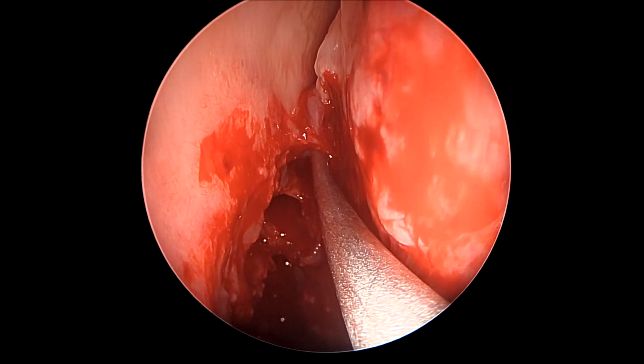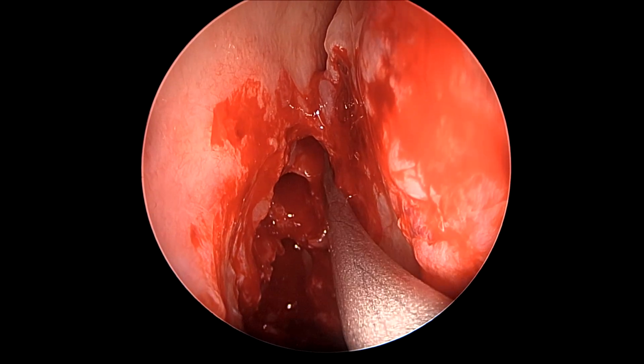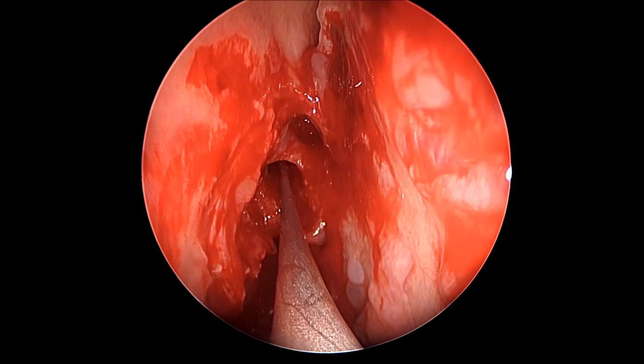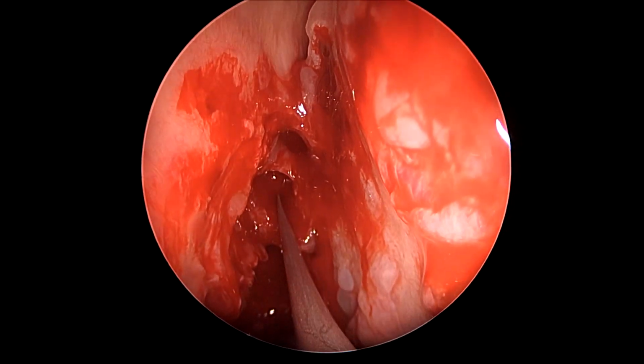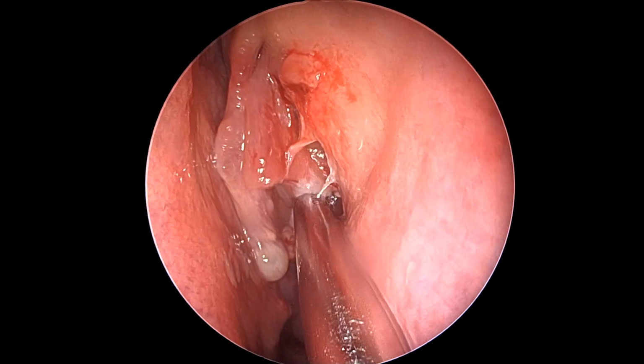Now this interfrontal septal sinus cell is only opening on the right side, not to the left side. So opening it on one side is good enough, and we get enough exposure. Both sinuses are nicely open, the ethmoid septations are fairly taken down, the maxillary and the sphenoid are open, and for the most part, the right-sided sinus surgery is nearly complete.